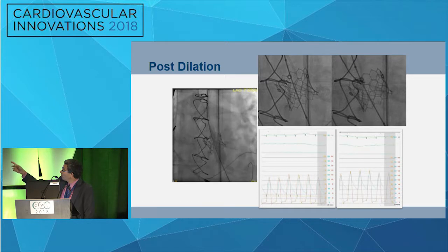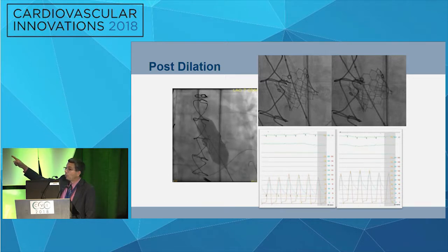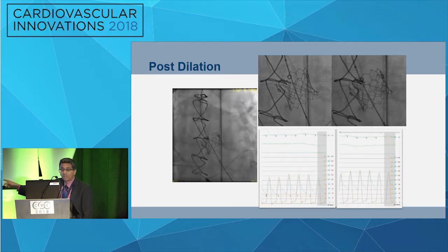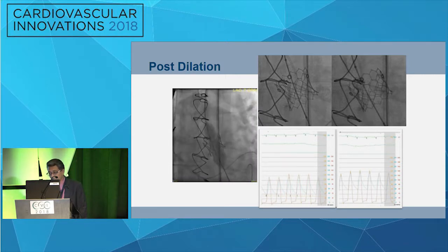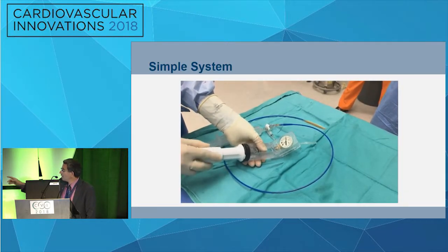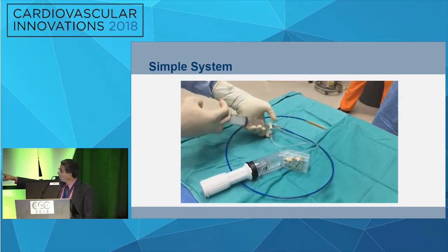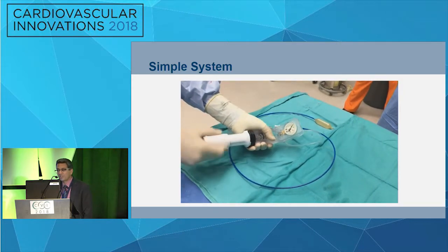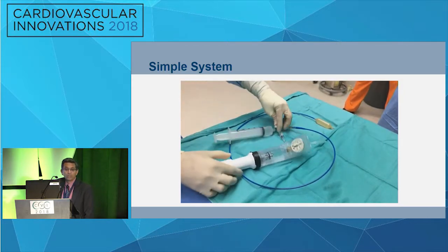And at the end of this, these are the two pictures, still frames, before and after, and you can see that the valve expands very visibly and fairly large. If you measure the gradient below, you see that the upslope of the aortic pressure is parallel to the LV pressure. So there is no instantaneous gradient, not just no peak-to-peak gradient. And how do we do that? This is a simple thing to keep in mind: if you use an indeflator, put the indeflator on the closed end and keep the pressure up, so you don't have to take time. I usually put the indeflator to 12 to 14.